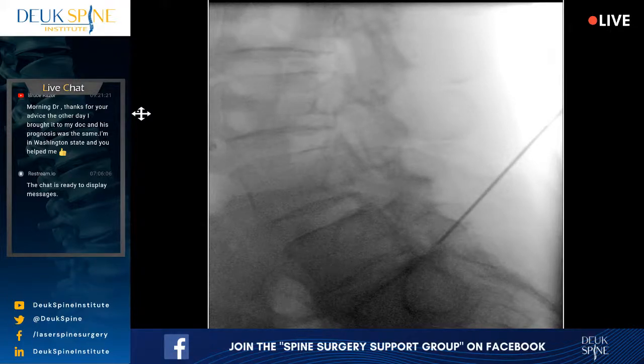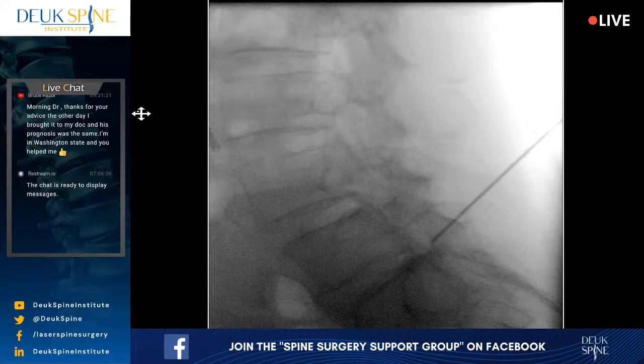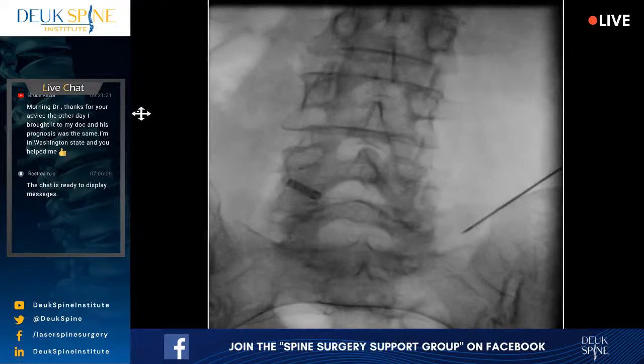Probably want to be a little bit more north. All right, we're getting close, Sean. Now let's get an AP view. So on the AP view, which is the front-back view, it's going to give me a better idea of how close I am to the back of the disc. So we use at least two views, lateral, which is from the side, and AP, to create a three-dimensional image in my brain as to where we are with the needle tip.